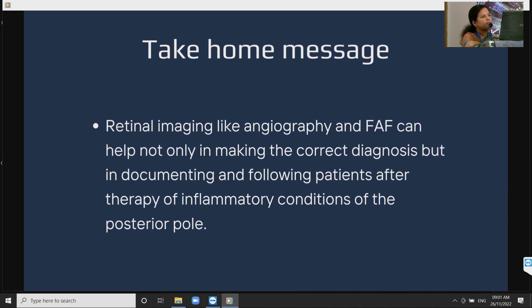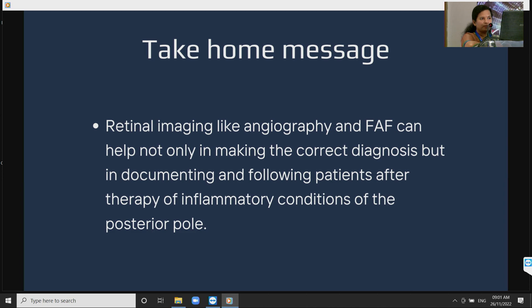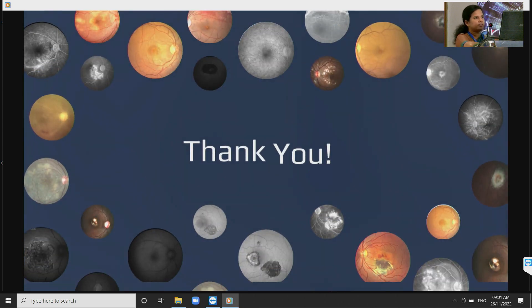Take-home message: FFA, OCTA, and autofluorescence help not only in making the correct diagnosis but also in documenting and following up patients following therapy in uveitic conditions.